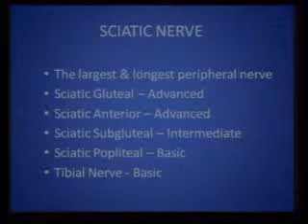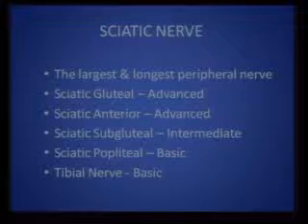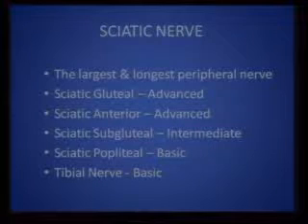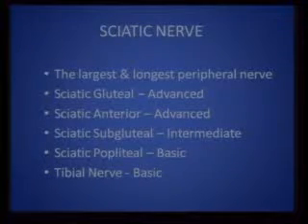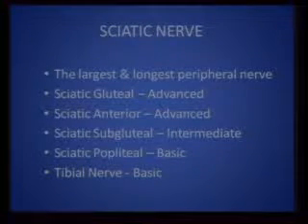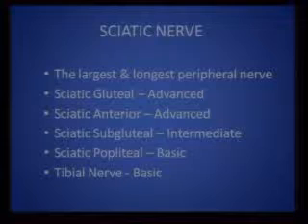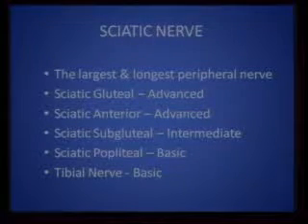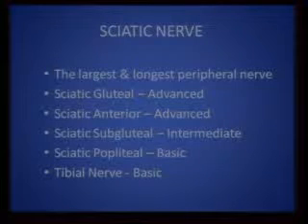The sciatic nerve is the largest and longest peripheral nerve in the body. But then Dr. Vincent Chan, who is a pioneer in ultrasound-guided nerve blocks and practices at the University of Toronto in Canada, has classified ultrasound-guided blocks into advanced, intermediate, and basic. Sciatic gluteal is advanced. Sciatic anterior is advanced. These two blocks are definitely not for beginners.